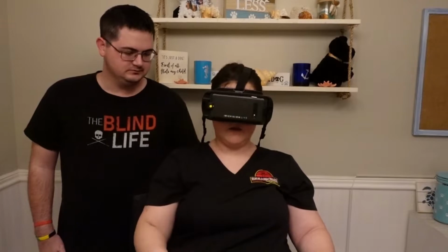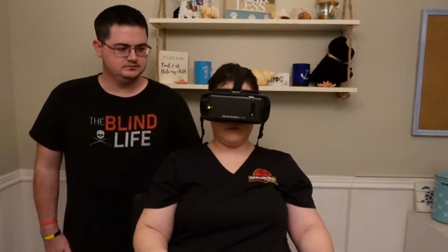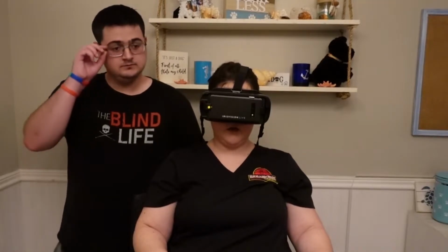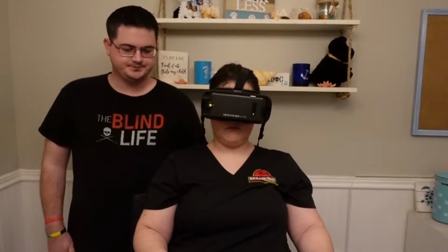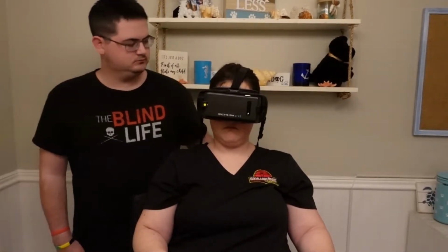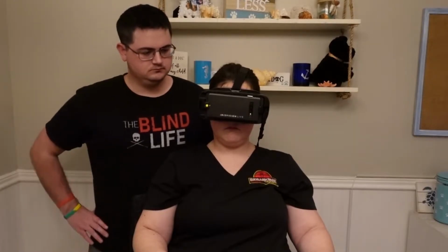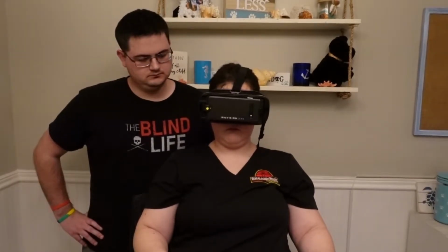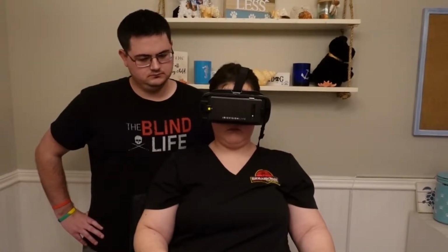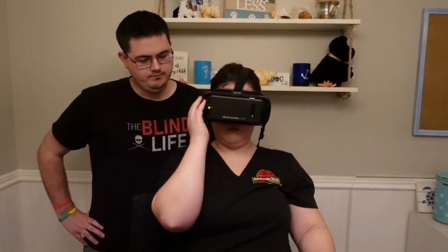You have reduced peripheral vision. So the area in which you see objects straight in front of you may be very small. You see only a portion of what a person with normal vision would. RP mode allows you to change the size of the field of vision such that all objects are inside your viewing area. So to increase the field of vision, to make it larger, you would swipe up on the touchpad.